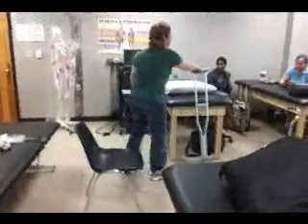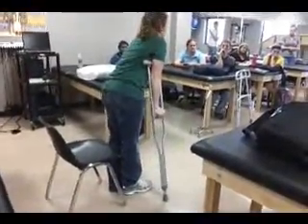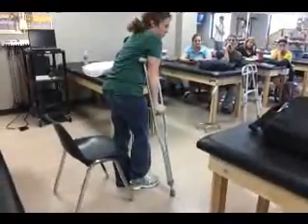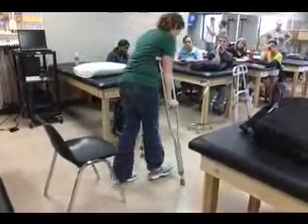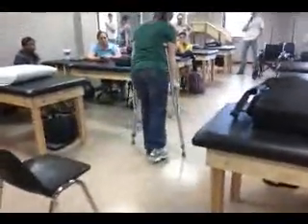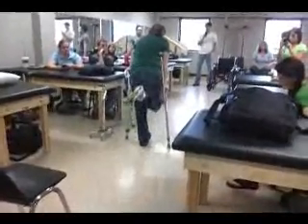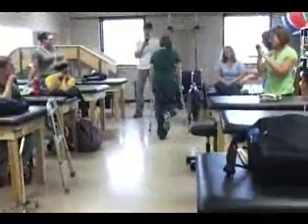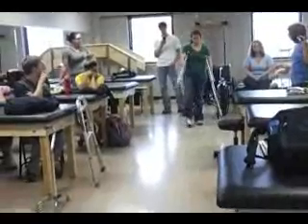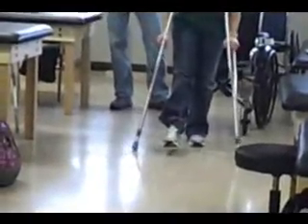If I am totally non-weight bearing, what kind of gait pattern am I going to use? 3-point. I'm always going to use 3-point. If it's non-weight bearing, it's 3-point. So I could do that with crutches. My crutches go, and then my good foot comes. Notice I'm not up here, because it doesn't replicate a more typical walking pattern with my foot up there. So try and encourage them to be as close to a typical gait pattern as you can.